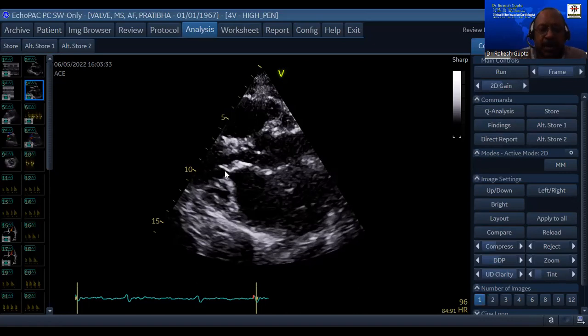Initially, all the patients present with rheumatic mitral regurgitation. We have not seen acute rheumatic valvulitis with patients presenting with regurgitation. So when these lesions heal up, the secondary cords become shorter compared to the primary cords, and this stretching of the leaflets by the secondary cords leads to doming of the leaflets of the mitral valve. And this doming is not found in any other condition. What we say a number of times is a hockey stick shaped structure. Now you can see this slide running.